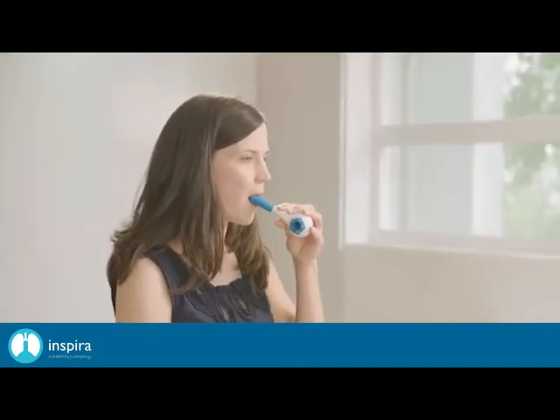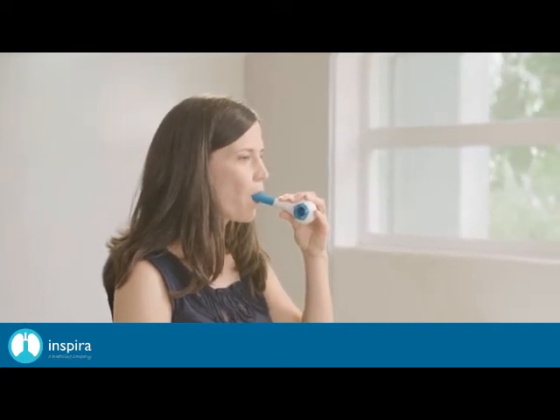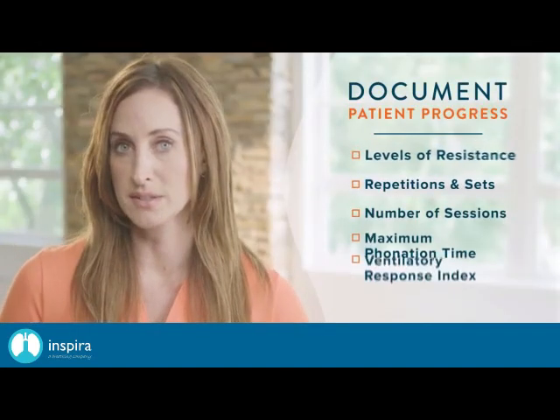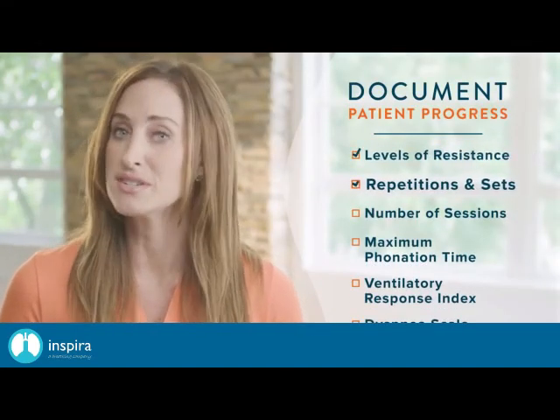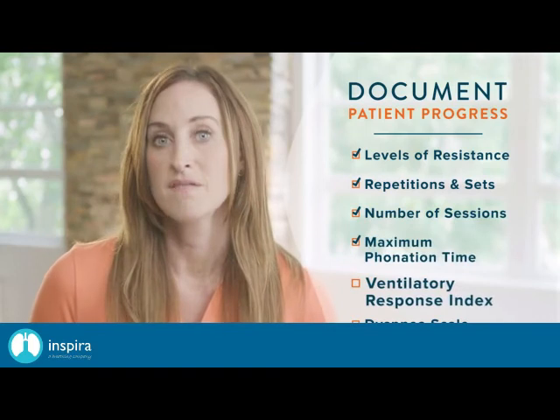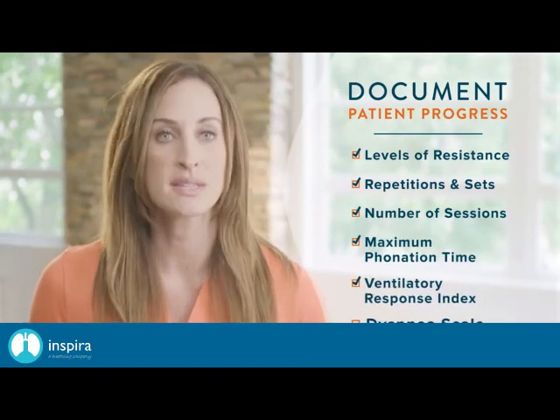Throughout treatment, remember, after maintaining training at baseline for approximately 1 week, assess if the patient can tolerate increase in resistances. Repeat each week or as tolerated. When resistance is increased, repetitions may decrease initially, then gradually increase again throughout the week. Document patient progress through levels of resistance, repetitions and sets, number of sessions, maximum phonation time, ventilatory response index, or using the dyspnea scale. Treatment goals depend on the underlying condition and patient status.